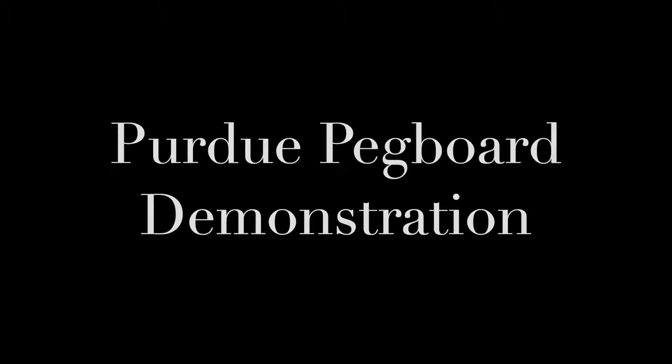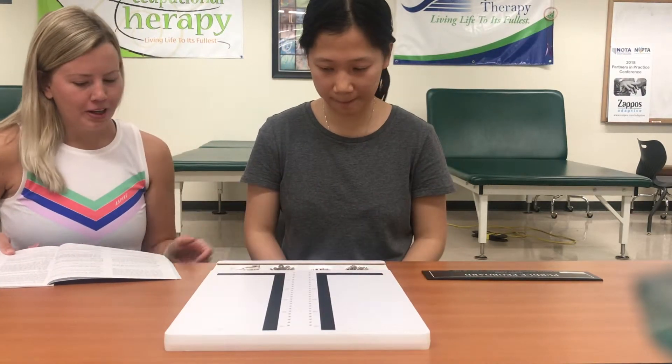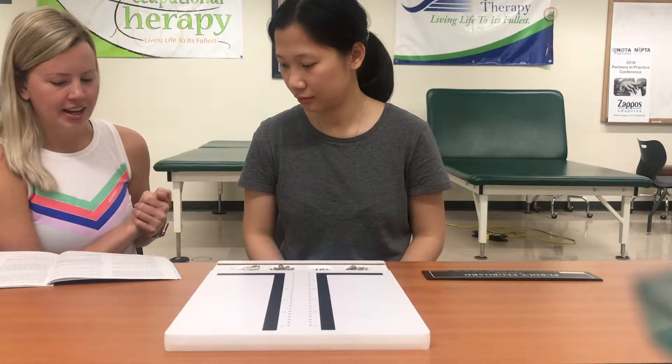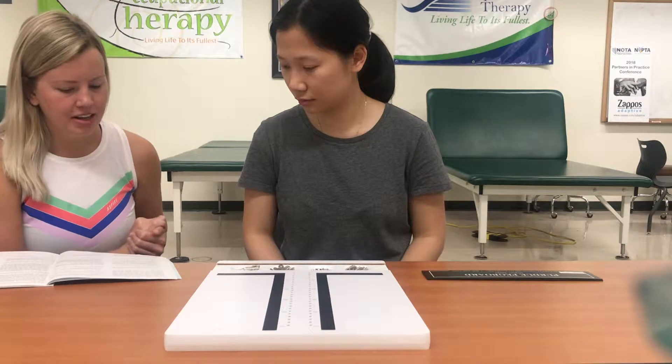We'll be administering one test for you, and you can do one trial or three trials. This is the Purdue Pegboard. This is a test to see how quickly and accurately you can work with your hands. Before you begin each part of the test you will be told what to do and then you will have an opportunity to practice.